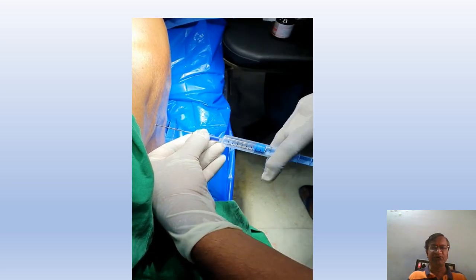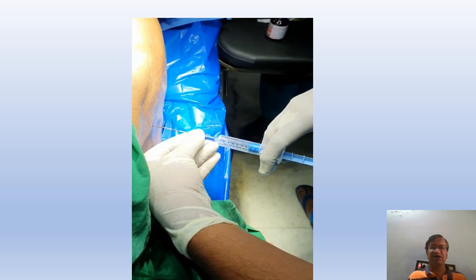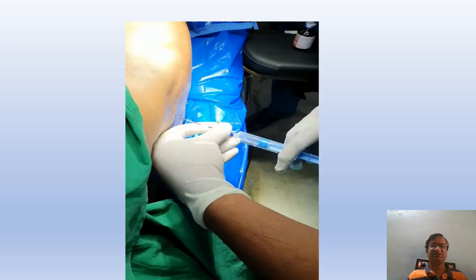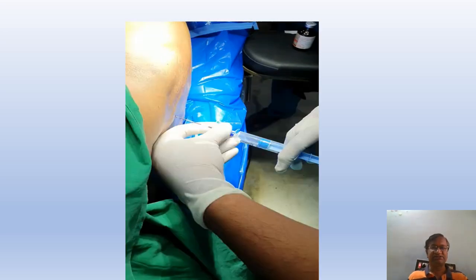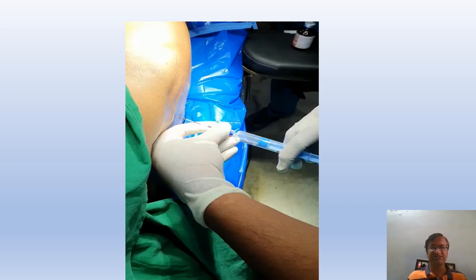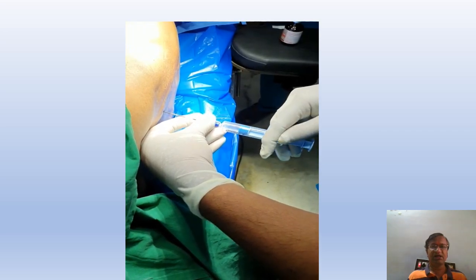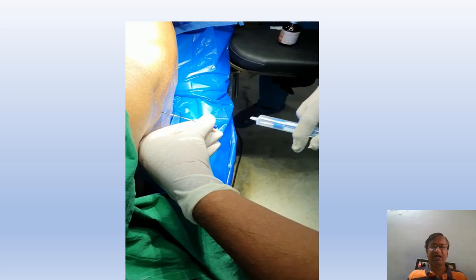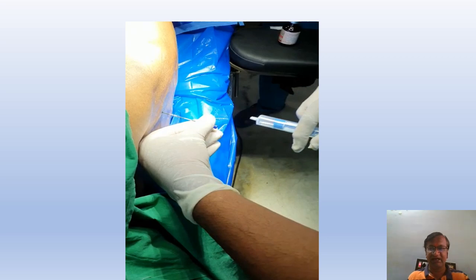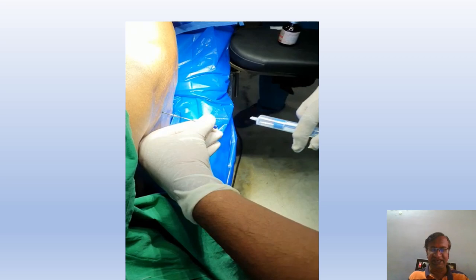Moving and tremulous action should not be at different times — they must be simultaneous. This is the Brahmaj grip. You can see the loss-of-resistance syringe here. I do not stop the tremulous movement when I am pushing the needle in — that is what is essential, because it avoids false negatives.